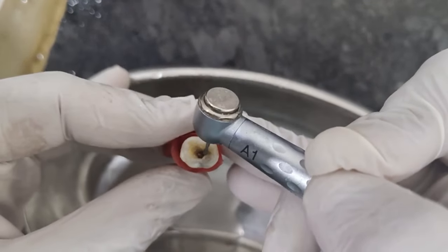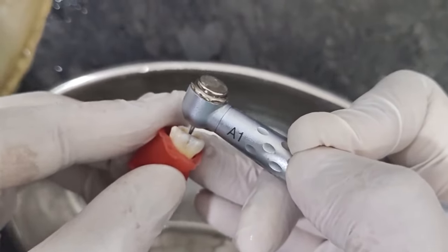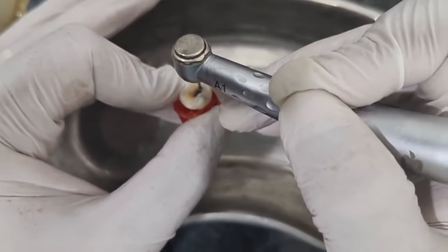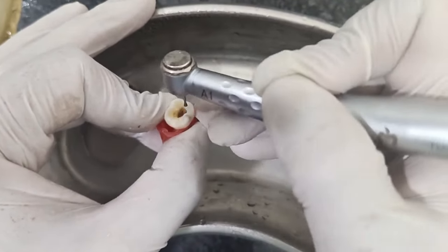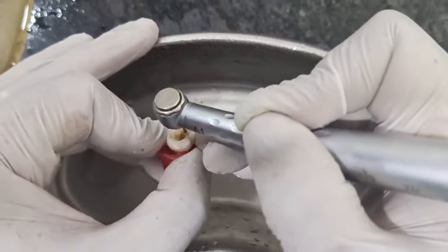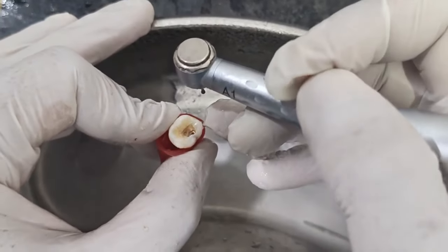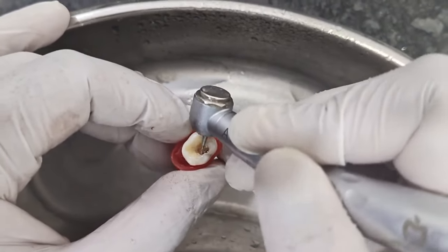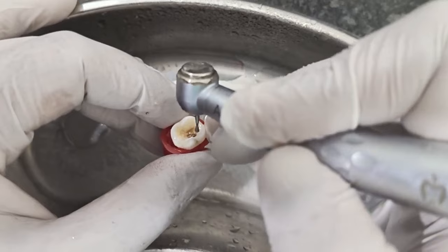And it's not necessary that you will always get the dip of the burr. Sometimes we may not get it because of the carious tooth, or maybe the roof of the pulp chamber is carious, so we may not always get the dip. So now I'm removing the carious region. Now you can see I have removed the carious lesion, and there is still some carious lesion present, and we need to remove it fully. Now we have removed the carious lesion.